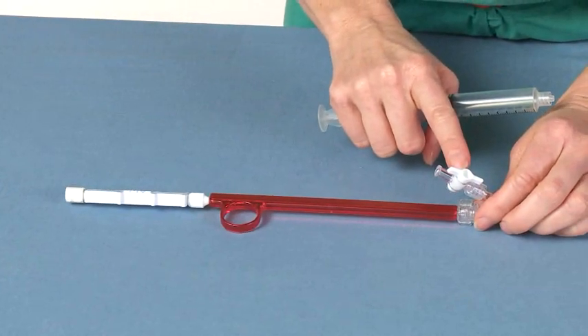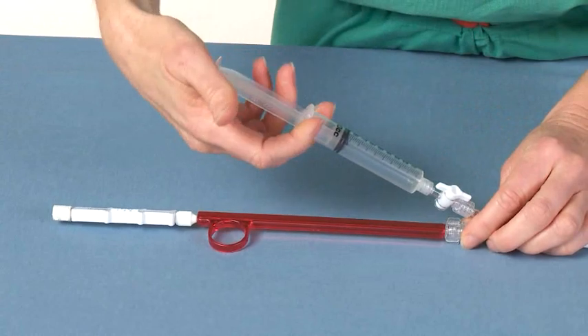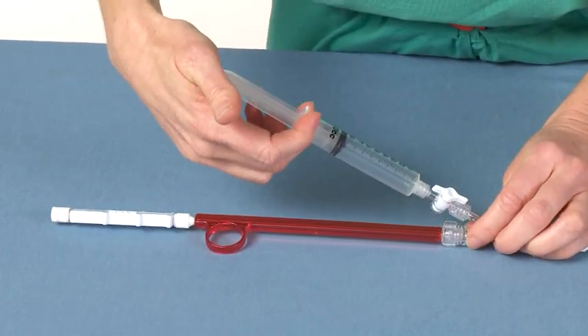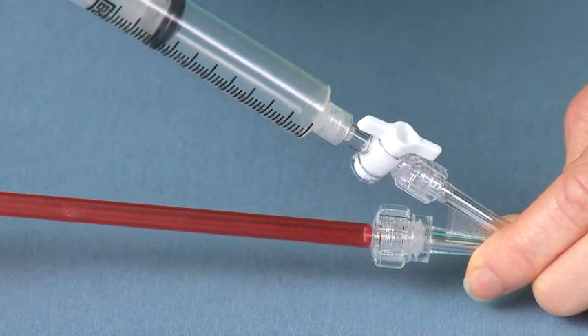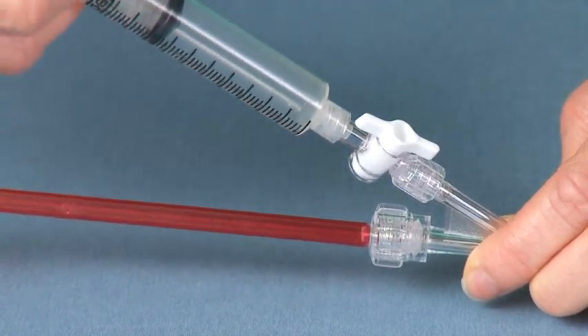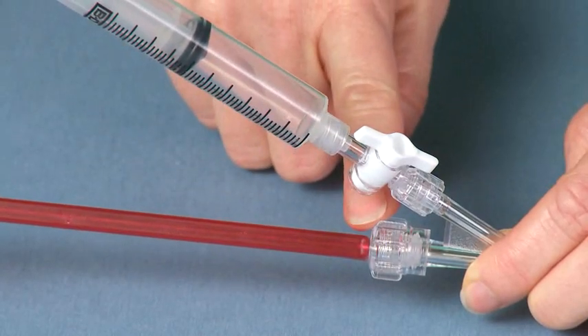Next, ensure that the two-way stopcock on top of the delivery system is open. Flush the Y-injection adapter and stent graft lumen with sterile saline by attaching a syringe to the luer port of the Y-injection adapter on top of the delivery system and apply positive pressure. Saline will drip out of the Tuohy-Borst valve.